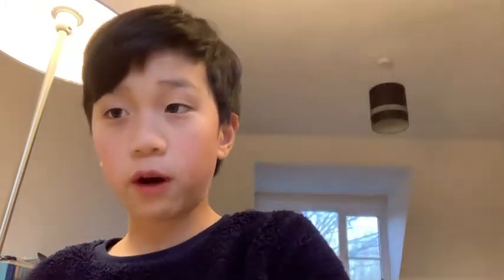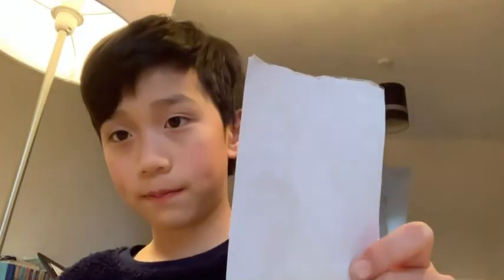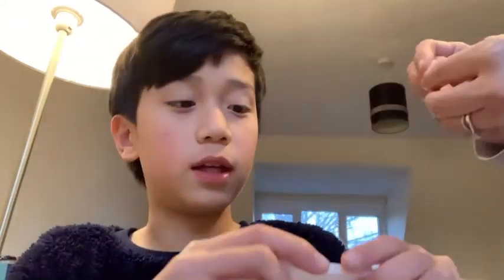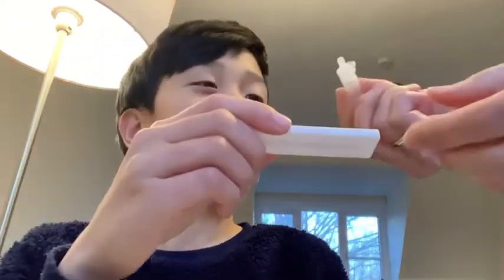When you're done with that, you should have this result tray, which also comes from the pack. You can see the 'S' marking — you have to put two drops of liquid into it, so my helper will do that.